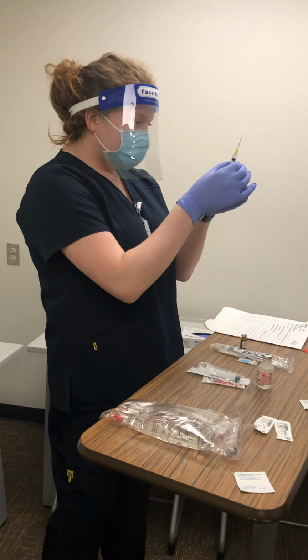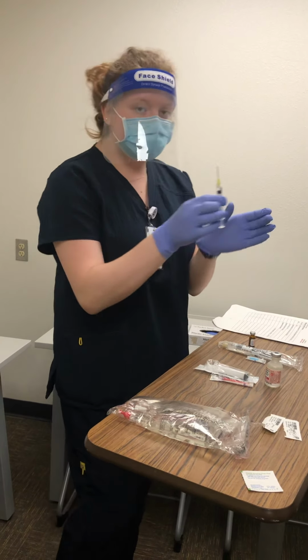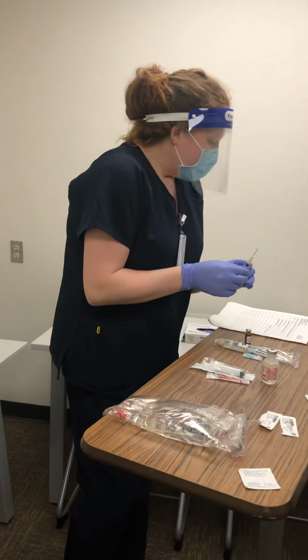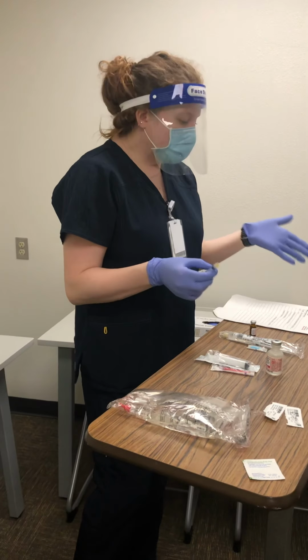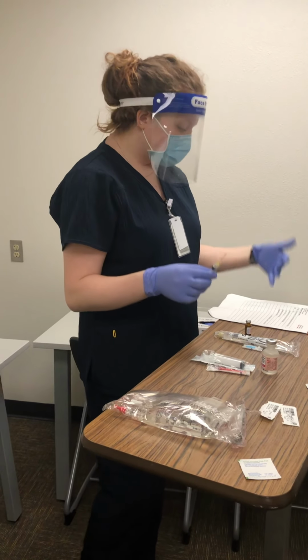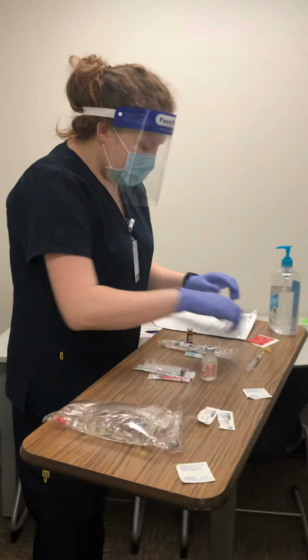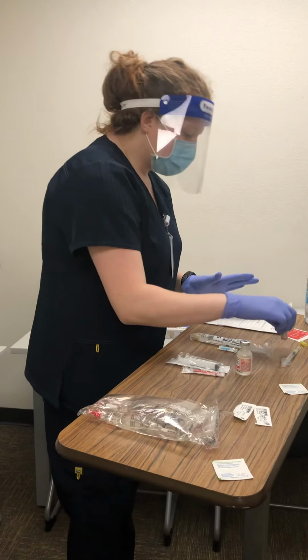Alright, so I'm just going to get the air bubbles out, and I verify with a second nurse that we are at 0.4 mL. Okay? And then I'd also, before that, I personally would have the nurse check my dimensional analysis, and it is correct. This morphine vial will go with me into the room.